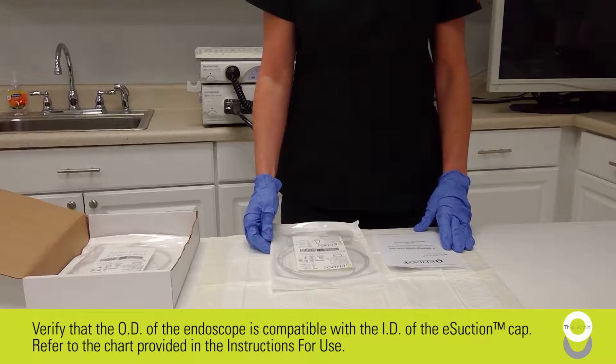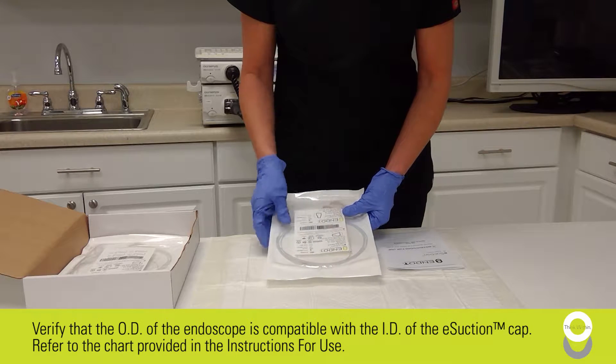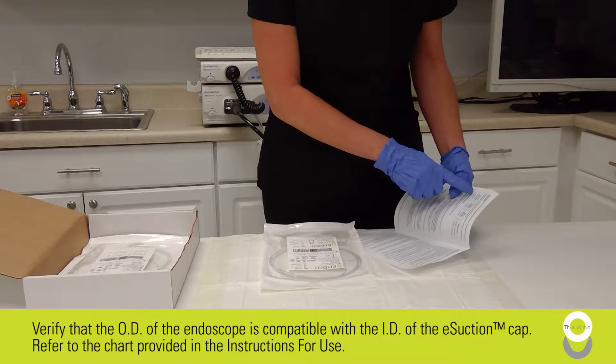Verify that the outer diameter of the endoscope is compatible with the inner diameter of the eSuction cap. Refer to the chart provided in the instructions for use.